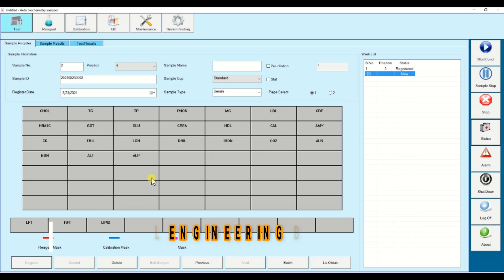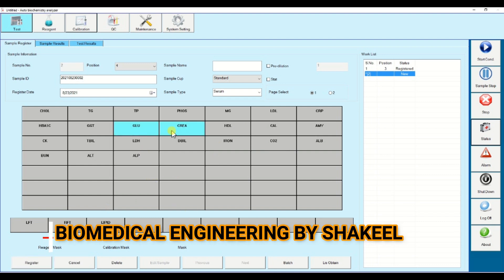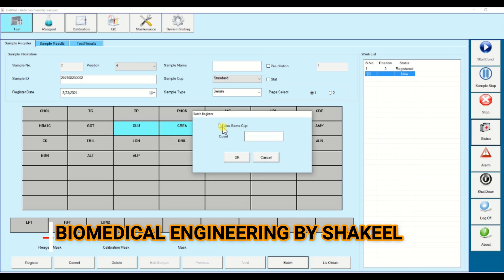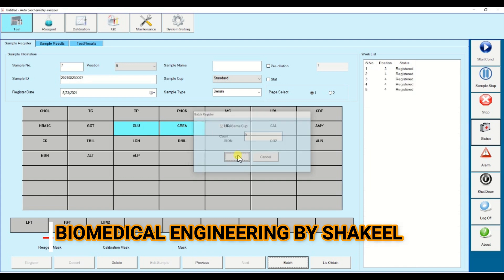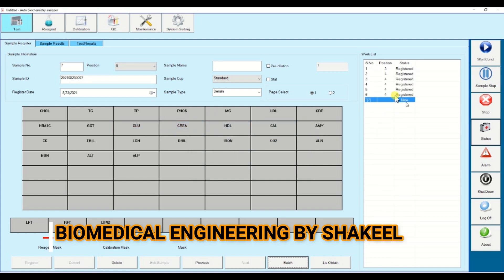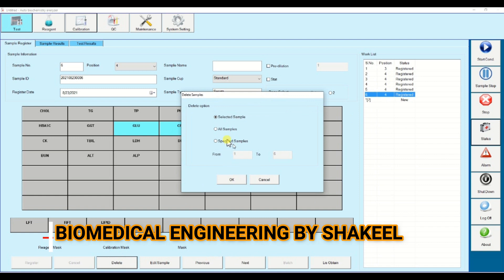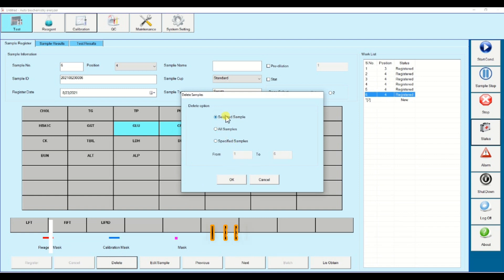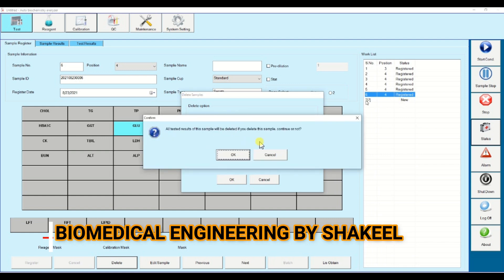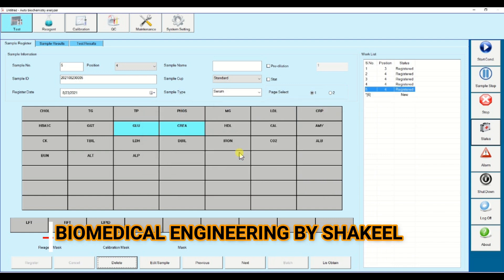If you want to run in batch mode, click on batch, select the tests, click on use sample cup, and enter the count of how many cups you have — suppose four, five, six cups. You can see that it will enter the same profile automatically for all these positions. If you want to delete, click on delete — it will show you options to delete tests from a specific range, delete all tests, or delete only selected tests.